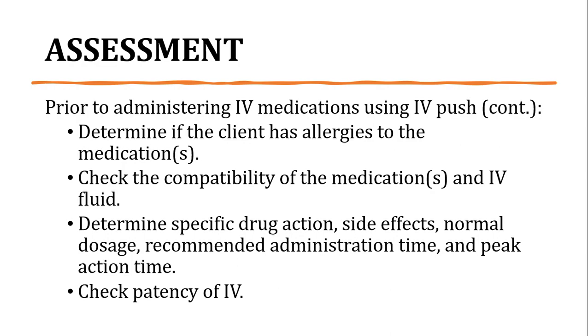Kapag in-administer mo yung medication doon, tapos na po ang administration ng medication, tapos i-unclamp na po yung IV tubing, tapos po kapag nagkaroon ng interaction yung IV fluid from the existing line and medication na in-administer sa client ay pagkakaroon po ng precipitation or something like that, which will cause harm to the client, lalo na po diretso siya agad sa vascular system ng client.